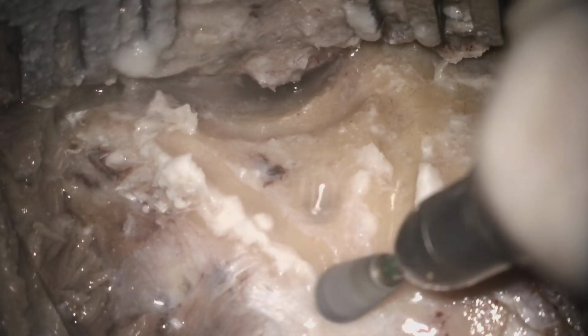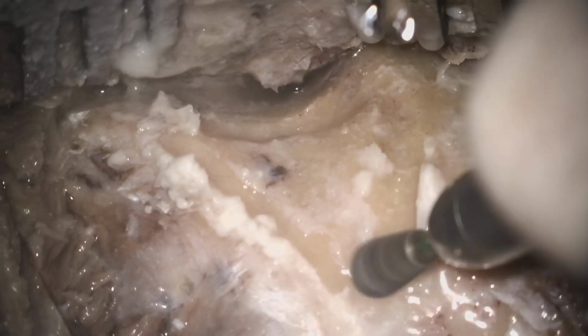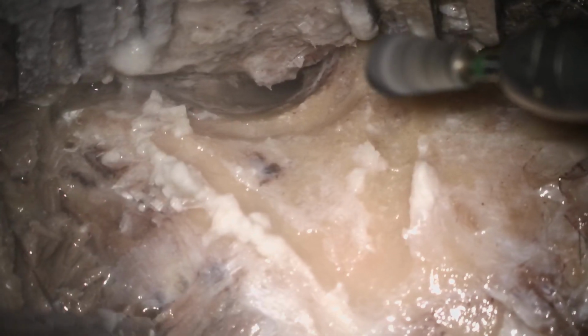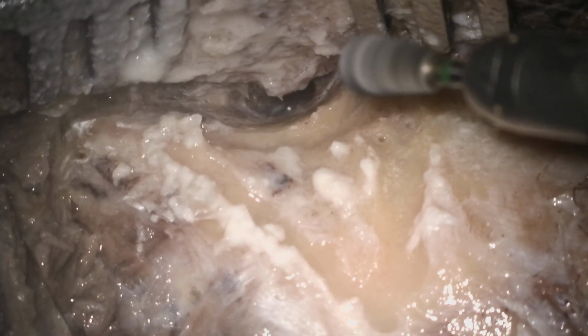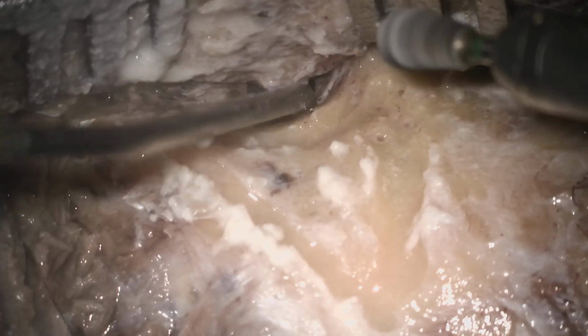Okay, like that. And the third cut will be the tangent line from the inferior border of the canal wall to the first line of the linea temporalis, that will merge at the sinodural angle. This is the boundary of the cortical mastoidectomy, and this is called the triangle of attack. In that triangle you can safely drill up to the mastoid antrum and you will find landmarks like the lateral canal, the digastric ridge, posteriorly the sigmoid sinus, superiorly the tegmen antri, etc.